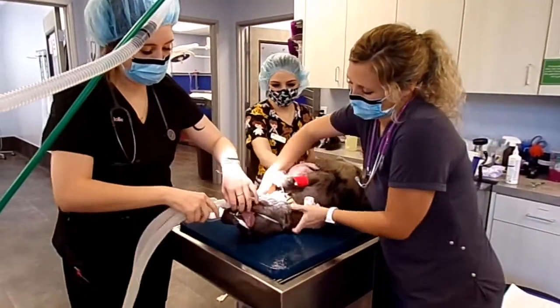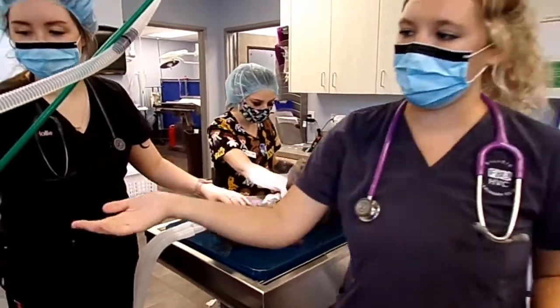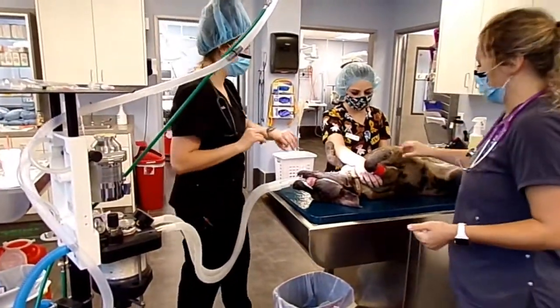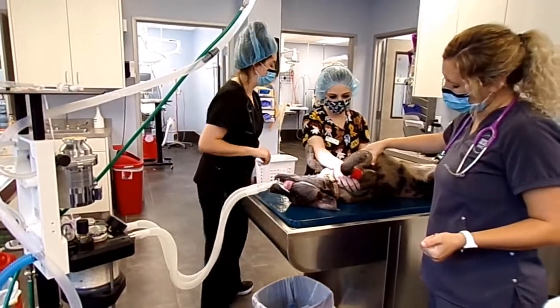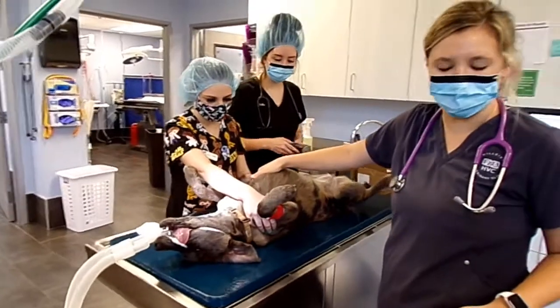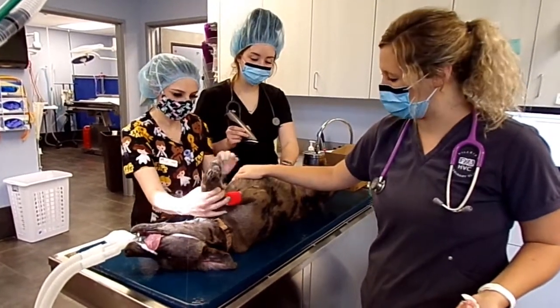Now we've got her flipped over and we're going to get her connected. We'll turn on our sevo and then turn on our oxygen. We're going to check her heartbeat — usually on these smaller dogs you can just feel it, but if you need to you can use your stethoscope. I can feel her heartbeat really well right here.